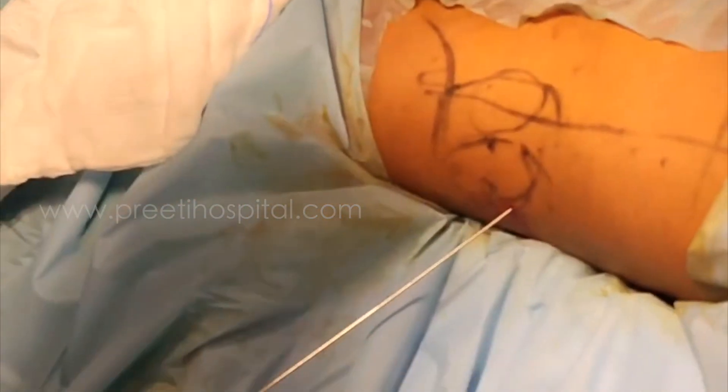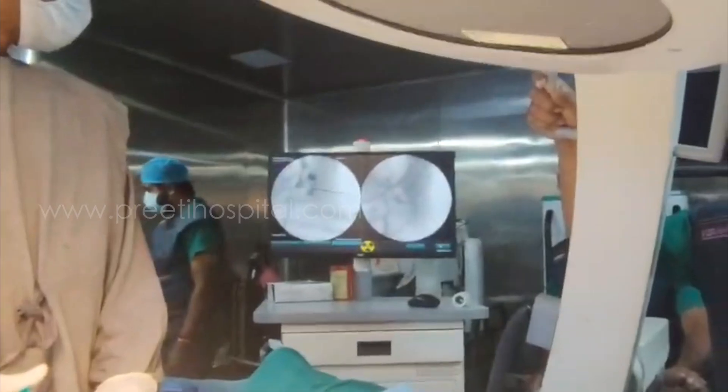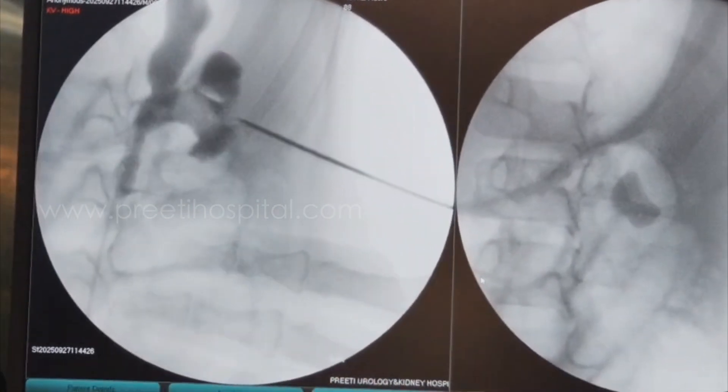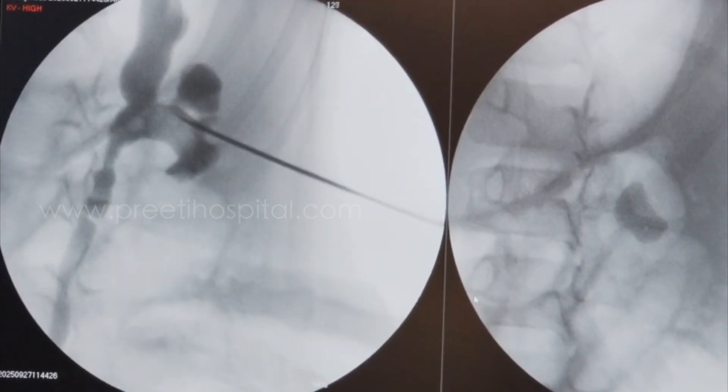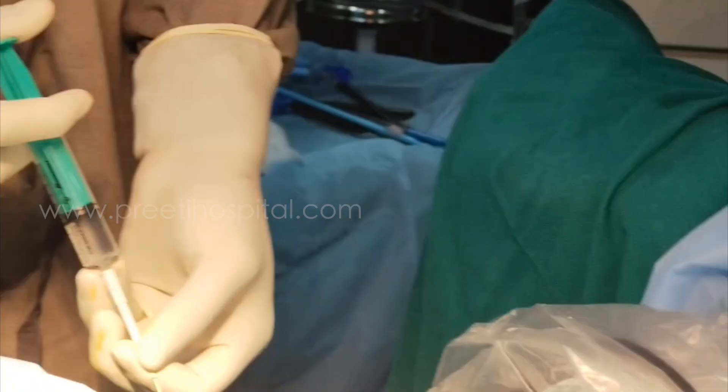Either I have to go a little more posterior, or I can come out and apply pressure, then go more posterior. I can see it is moving more and more. Now, in this direction I should be there. Now I am applying — I can see it is going through the periphery.